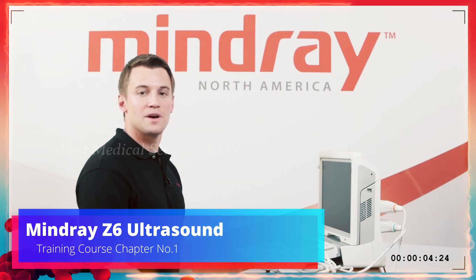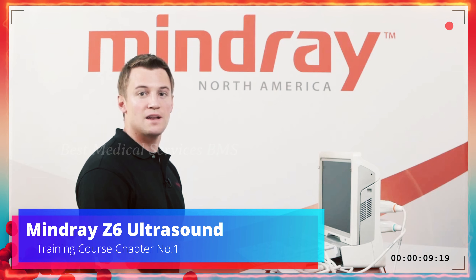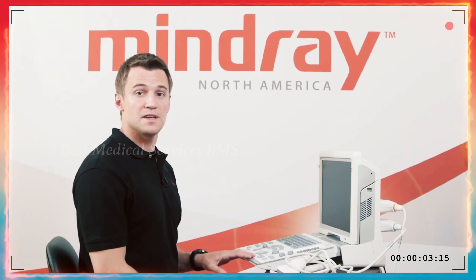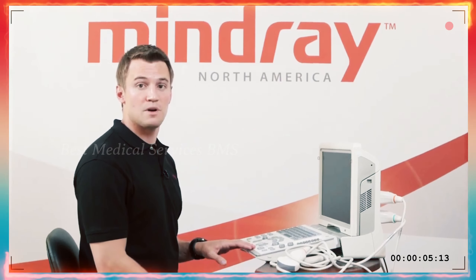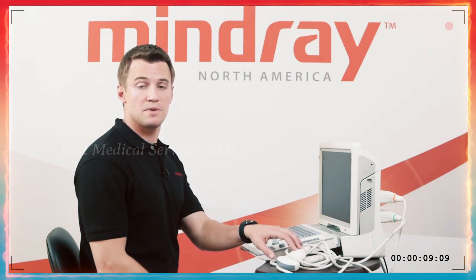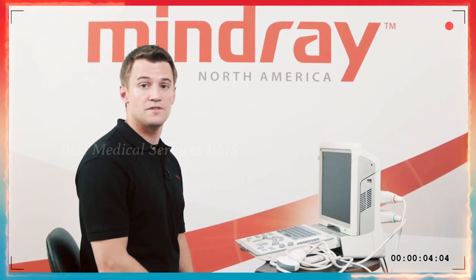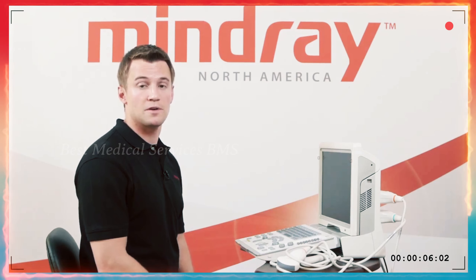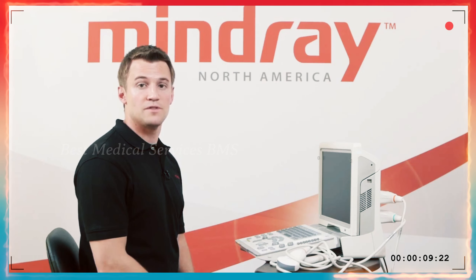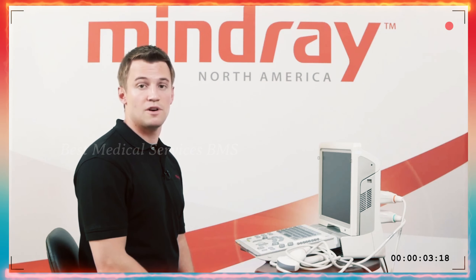My name is Johnny Barch with Mindray Ultrasound, and this is the Mindray Z6 ultrasound machine. When you buy it and it comes to your facility, it will come in a couple of boxes. You'll have the Z6 and the batteries in one box along with the power cord, your transducers in a separate box depending on how many you bought, and a box for the UMT150 cart if you chose to purchase it. I strongly recommend following the directions for the UMT150 mobile cart, as it is simple to follow. It takes about 30 to 45 minutes to put together.